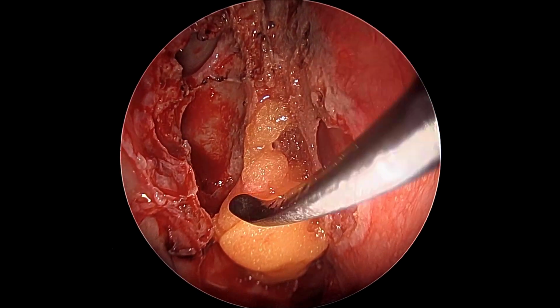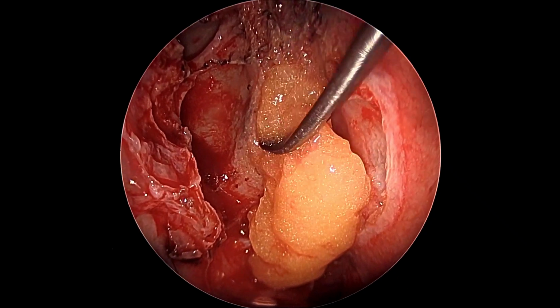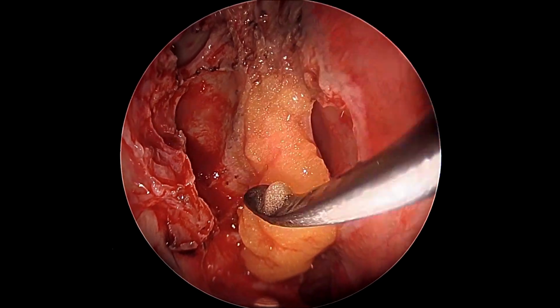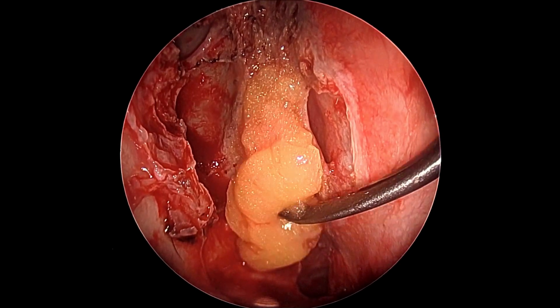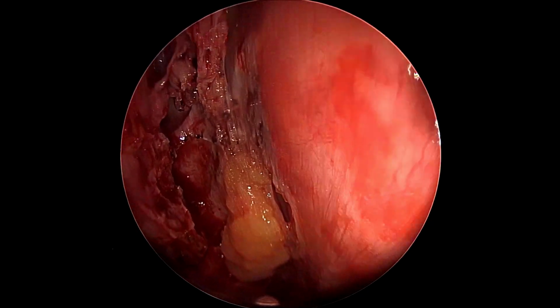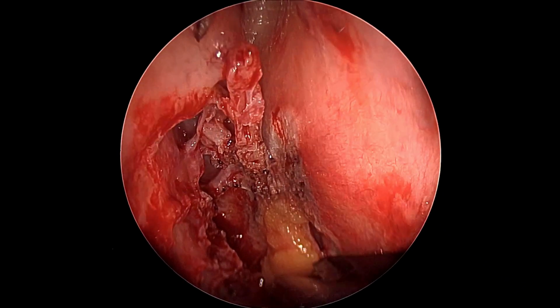So here we start pushing this fat gently inside the defect. We can place it alongside the undermined dura as well as inside. The point is to make a sort of seal where some portion of it is inside the intracranial cavity and some portion is outside.